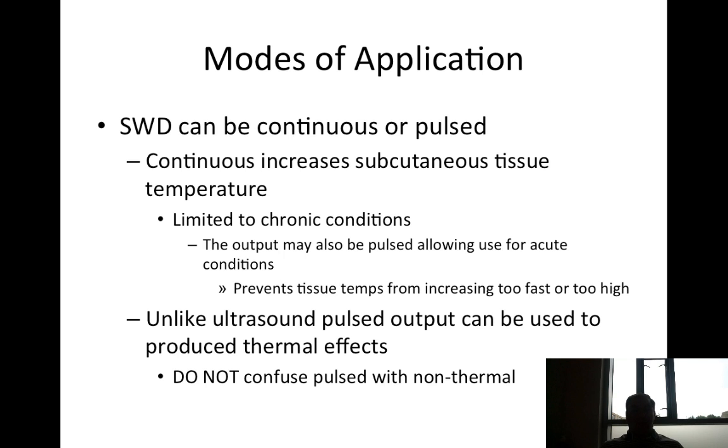Unlike ultrasound, pulse current can be used to produce thermal effects. So do not confuse non-thermal and pulsed for diathermy. Ultrasound is different. This is where students get confused, and I don't want to screw you up here. Unlike ultrasound, pulse current can still be used to produce thermal effects with diathermy. Do not confuse non-thermal and pulsed diathermy. It is different than ultrasound.